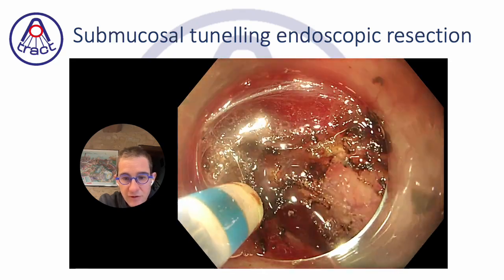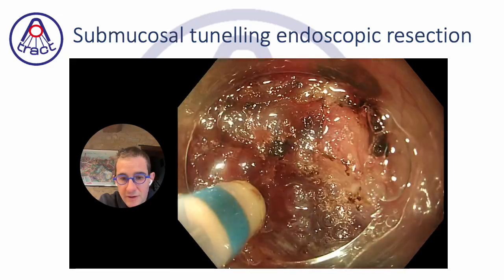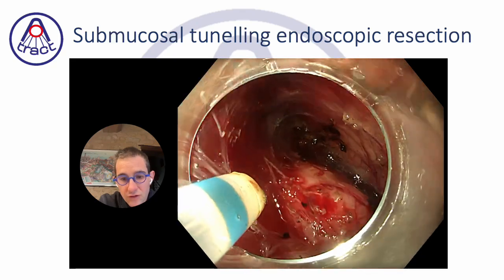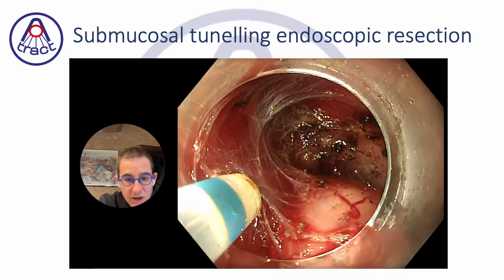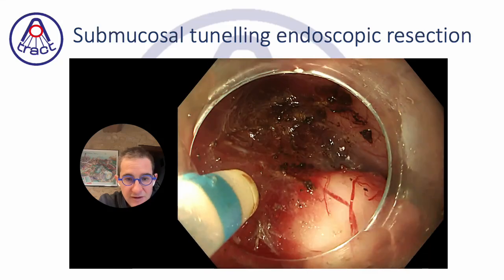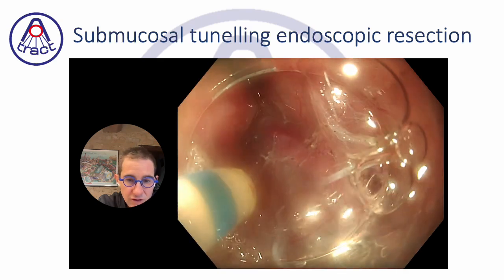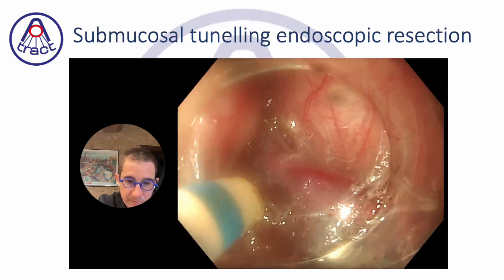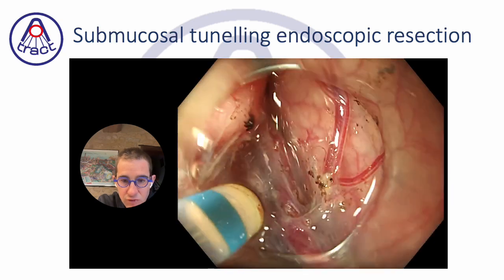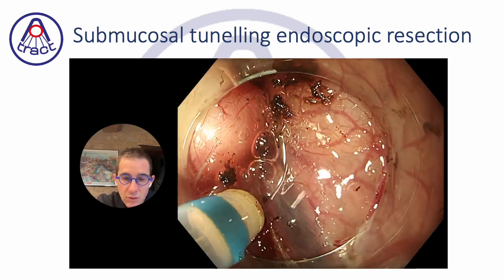I think even more than in ESD, it's probably better to control the bleeding quickly in order to avoid this kind of coagulation of dark spot that makes the ESD less precise, because once again, our goal is to avoid any damage on the lesion in order to be able to have a complete resection and to stop any follow-up for the patient.